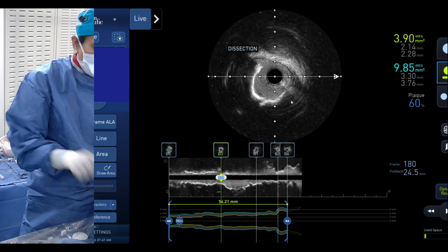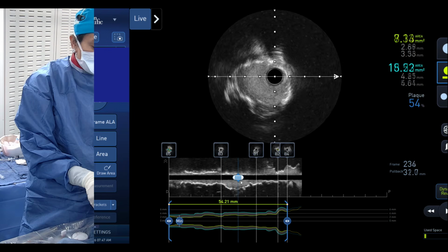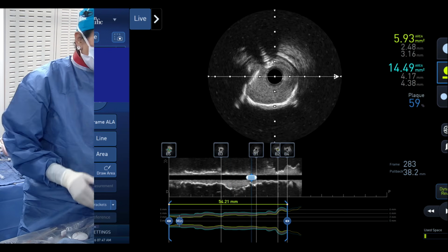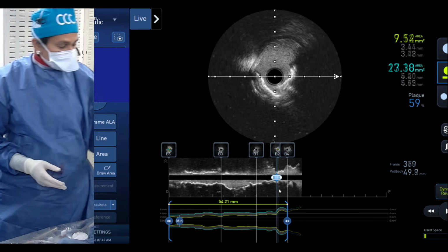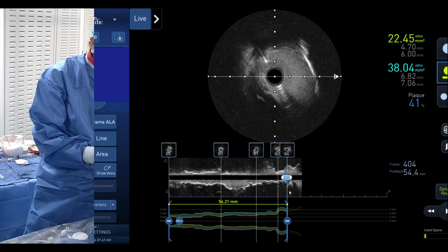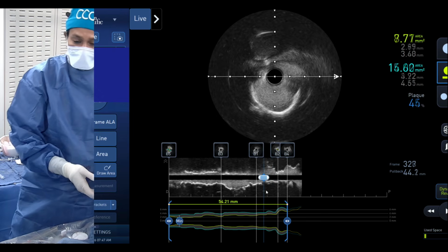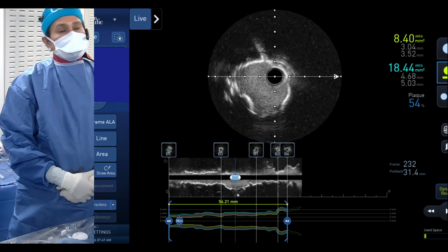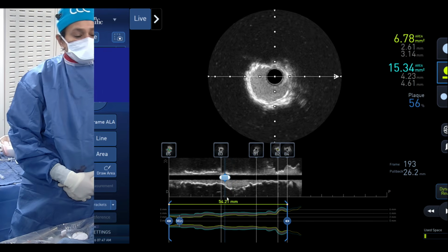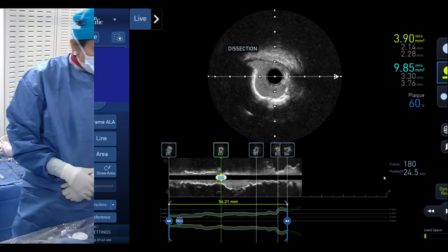Okay, the point is I gave 3 pulses, can I come out, or do I have to go back and finish all the pulses? That is difficult for us to come up with yet, unless you have done imaging multiple times. Give 3 pulses, image; give 6 pulses, image; and then we understand what each of these 3 pulses or 1 pulse is doing.